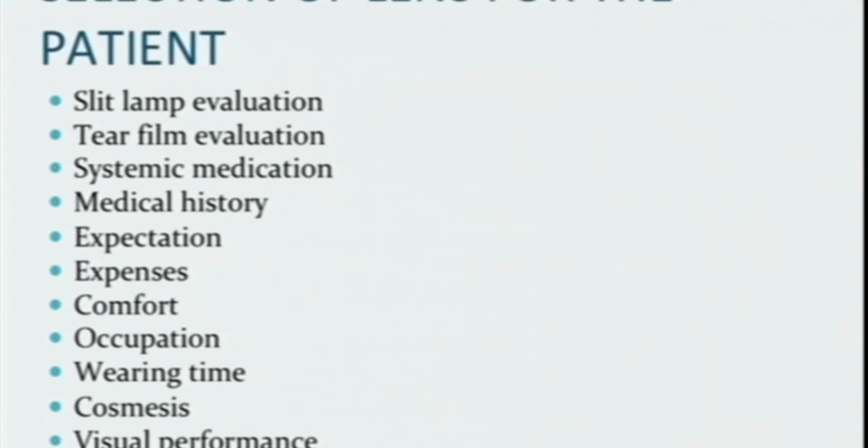And how do you select the lens for the patient? Evaluation of the patient with the help of a slit lamp, tear film evaluation, systemic evaluation, and the expectation of the patient, and the financial condition of the patient also is more important, along with the occupation and wearing time.